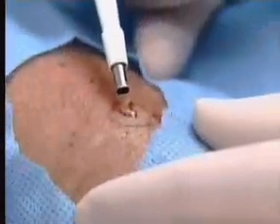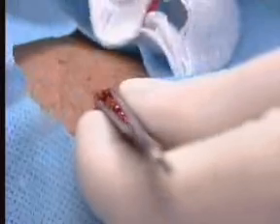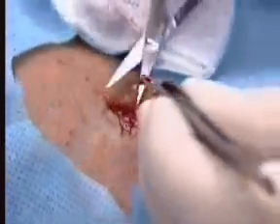Remove the punch. You will see the mole come out with the punch and sit on the surface. If the mole sticks to the punch, you may have to extract it. It may also be necessary to snip the base, removing the small amount of fatty tissue that is there.